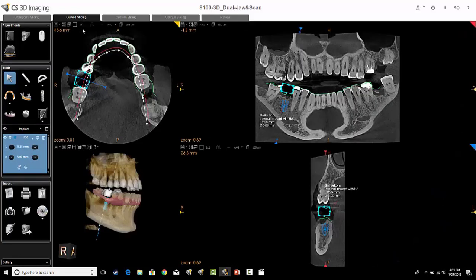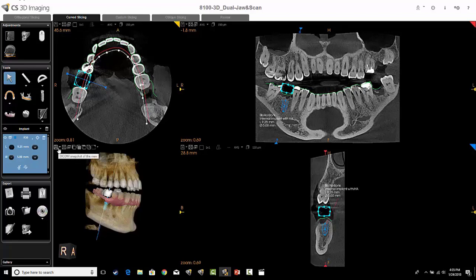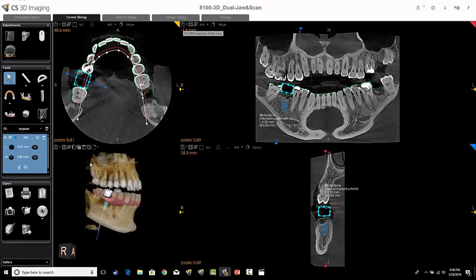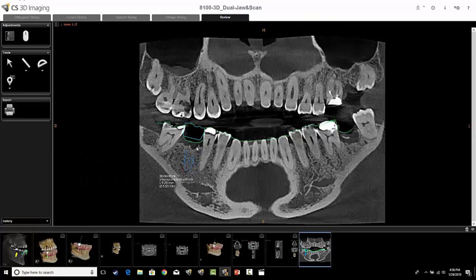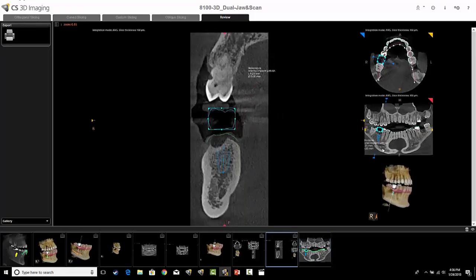Another way to capture is using the individual capture icons in each of the views. You can see a picture of a floppy disk in each of the four views. It's actually a DICOM screenshot used in different DICOM viewers, such as the Film Composer report in the CareStream software amongst others. Selecting this screenshot also captures it down in the gallery, and that particular image is just an individual image of that particular view with no orientation views on the side panel.